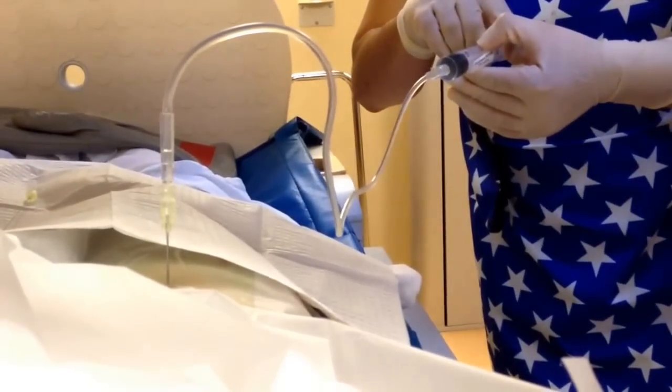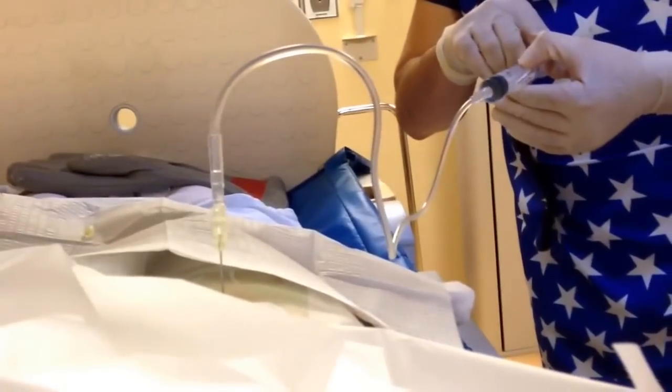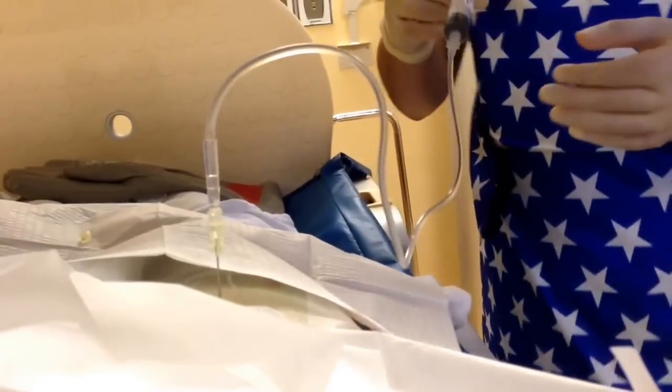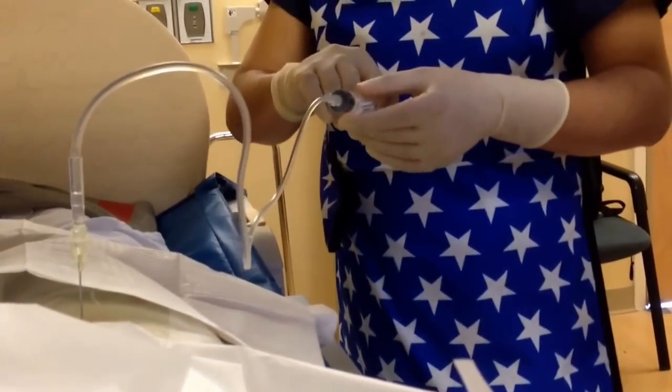I feel like my leg is turning on its own. Do you feel okay? It doesn't feel full — I feel my leg rotating inward slightly. All right, let's take one more image. I'm going to take one more x-ray.